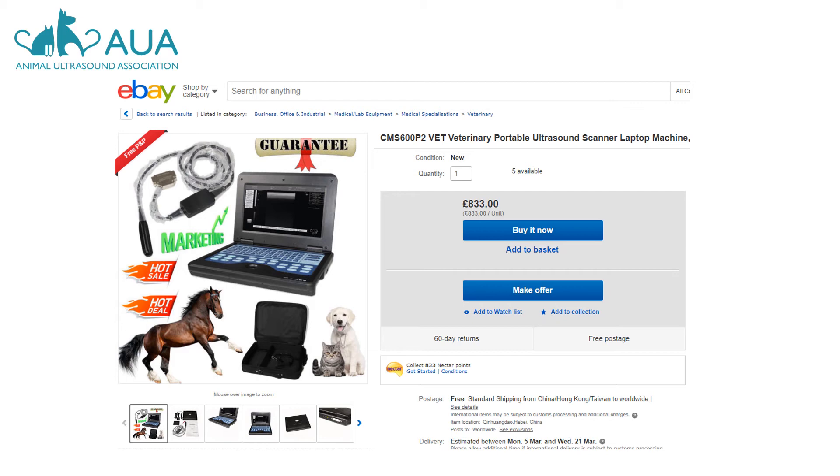Other listings are not so clear. In this eBay listing, there is no mention of the probe type, only a picture. Those not familiar with ultrasound might not even notice that there's a problem with the probe here. There's also a picture of a dog and a cat, which leads the buyer to believe that this transducer is suitable for small animal use.